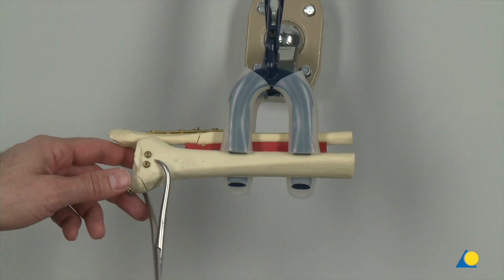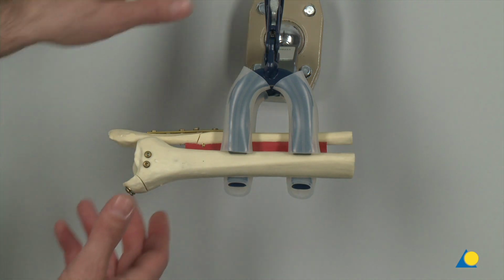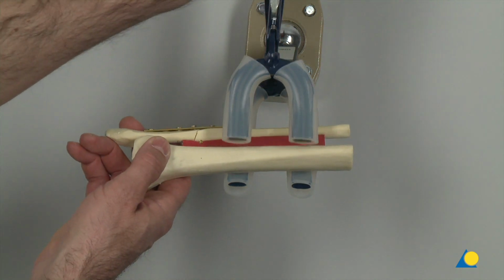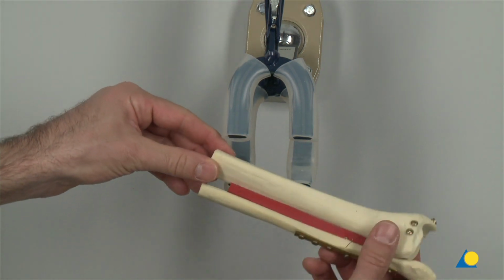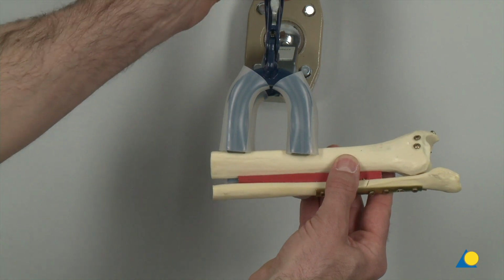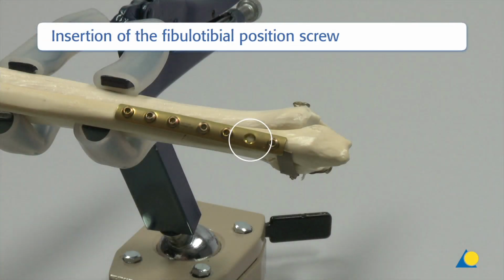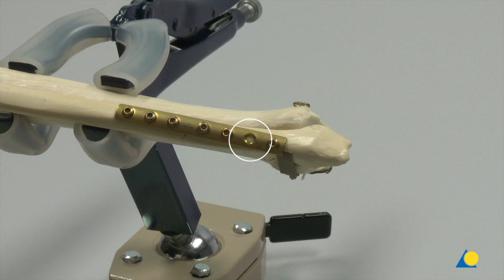The reduction forceps is removed. To facilitate the insertion of the position screw, the bone model is released from the clamp and rotated 180 degrees. To facilitate the insertion of the position screw, the bone model has been returned to its original position.